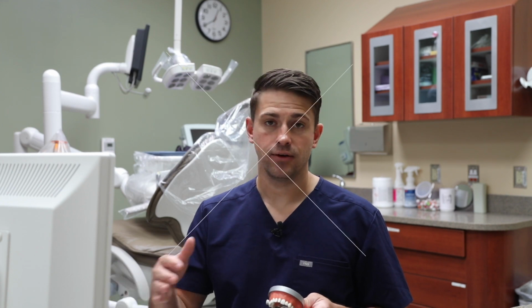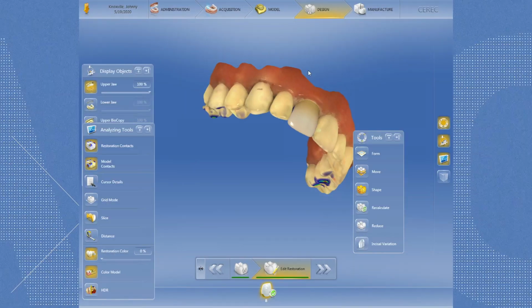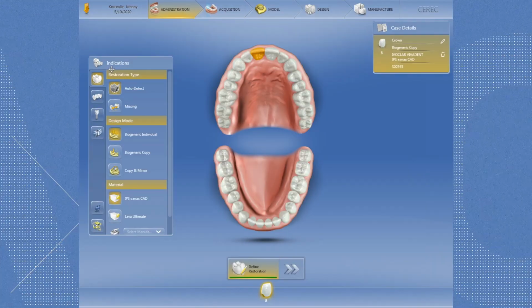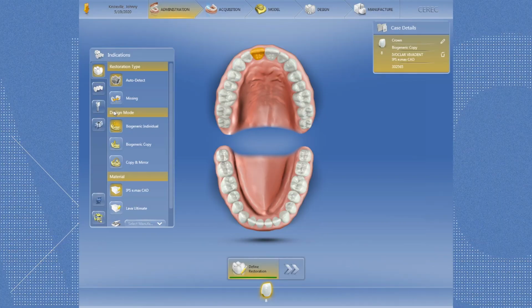But I prepped number 8, and then I went through the whole process of taking this through the CAD/CAM fabrication process. So using Cerec, I'm currently running 4.6. I enter in the actual restoration that I'm going to be doing, so I select the tooth, I select the material, e.max CAD in this case.